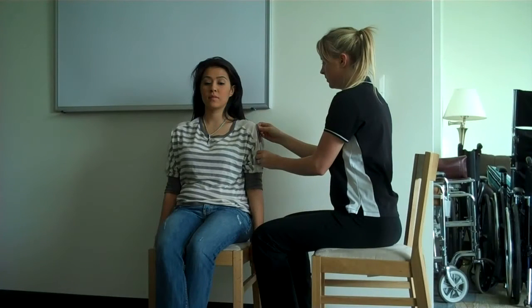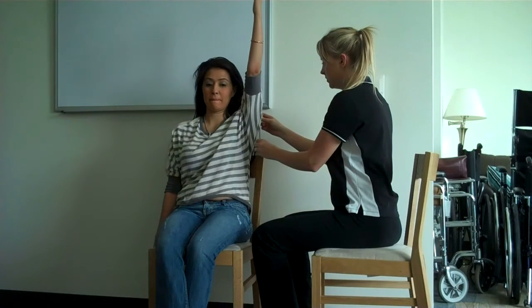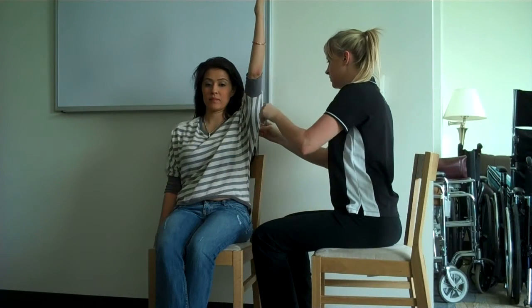The client's arm is raised in front of her body in a sagittal plane of movement. The measurement begins at 0 degrees and ranges to 170 degrees.